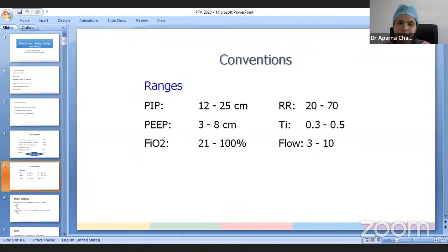Now, in a baby who begins with a short I time versus a longer I time, the effect on ventilation itself may be that there may be ineffective delivery of the pressure, resulting in slightly lesser tidal volumes being generated. Whereas if you give adequate I time, we are going to be able to deliver the peak pressure that is intended and hence achieve the tidal volume that is of interest. So as you can see here, short I time can result in inadequate delivery of tidal volume.